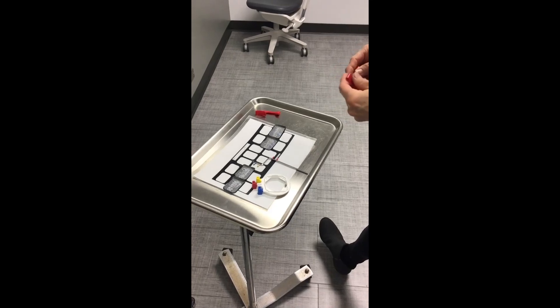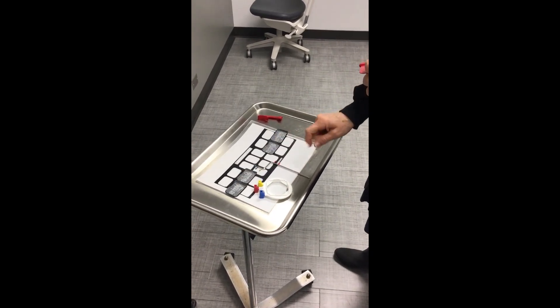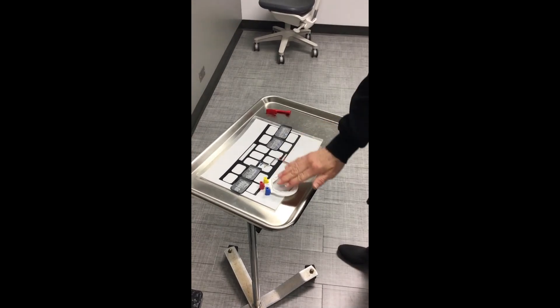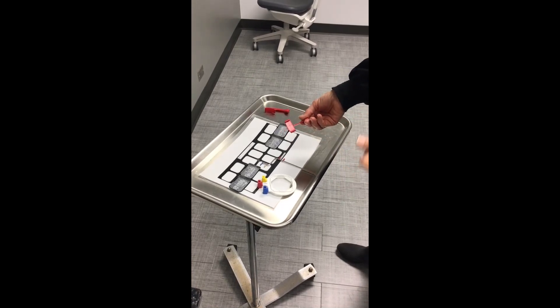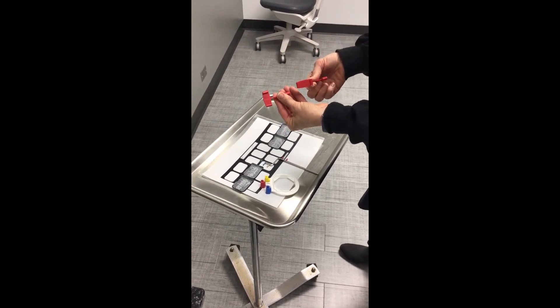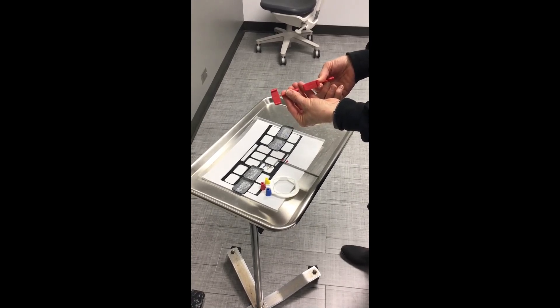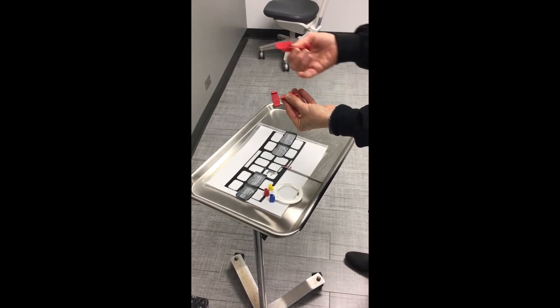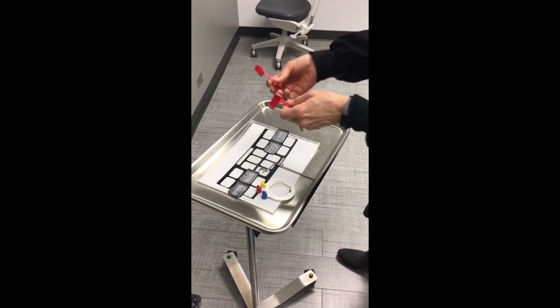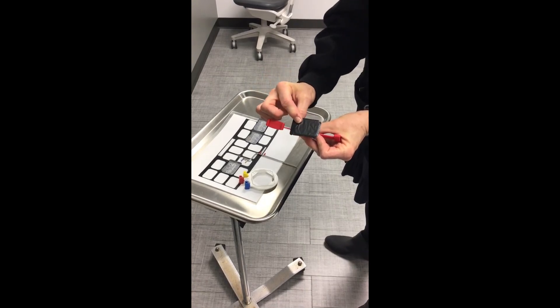Now we're going to demonstrate how to perform bite wing radiographs. Typically you take four bite wings on an adult patient using size two sensors, and you can see where they are laid out on your sequence chart. You'll have your ring, your arm, and your bite block. In the kits you have two different bite blocks — one sitting up vertically and one sitting horizontally. When taking horizontal bite wings, which is standard unless your patient has periodontal problems, you use the one sitting up vertically. You would use the one sitting horizontally for vertical bite wings. You can see how the sensor fits here for vertical and here for horizontal.